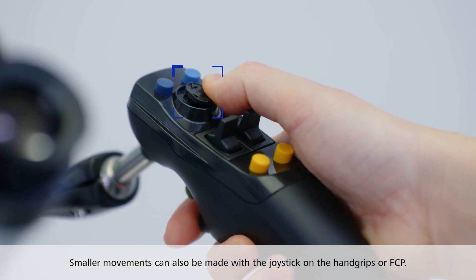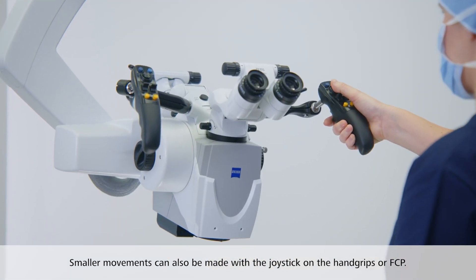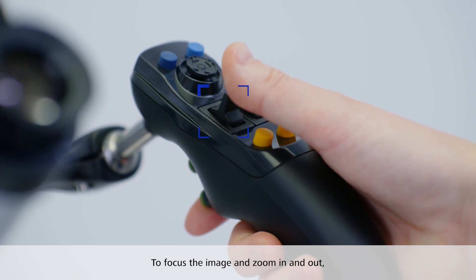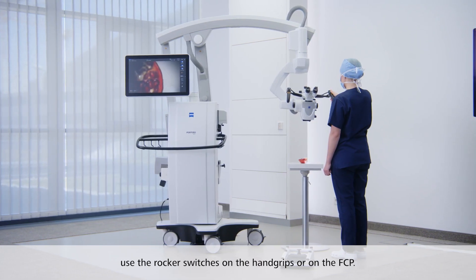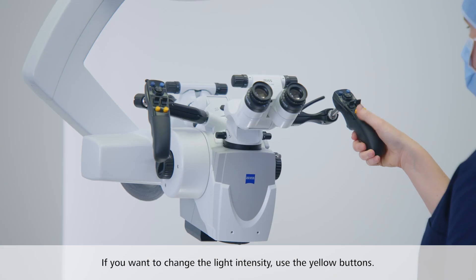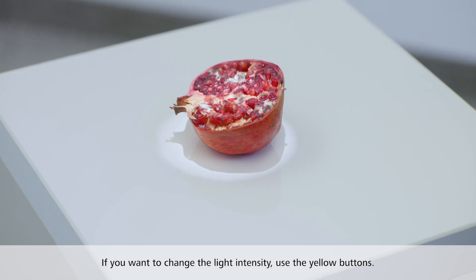Smaller movements can also be made by using the joystick on the hand grips or on the foot control panel. To focus the image and zoom in and out, use the rocker switches on the hand grips or on the foot control panel. If you want to change the light intensity, use the yellow buttons on the hand grips.